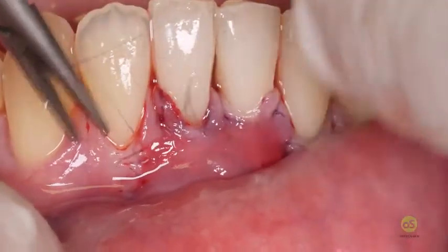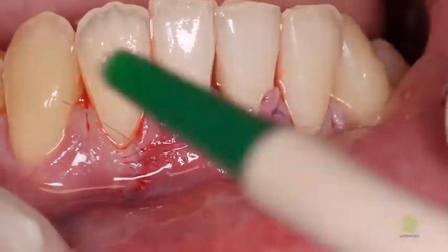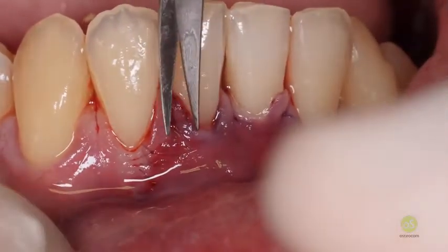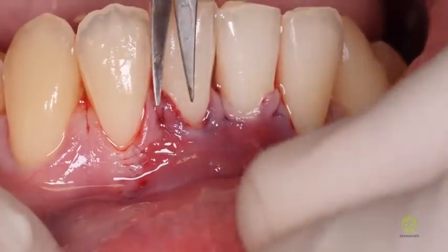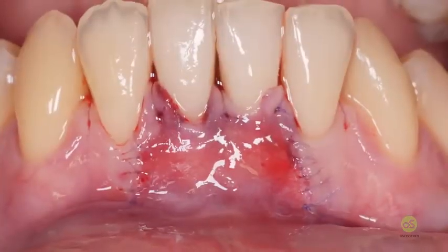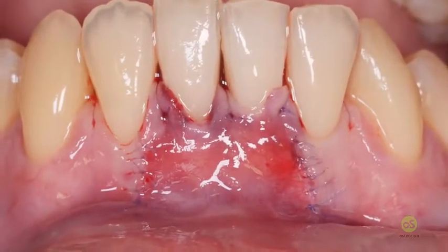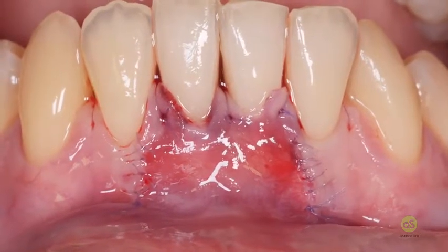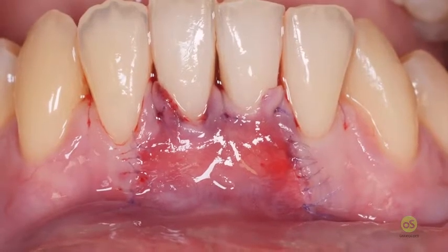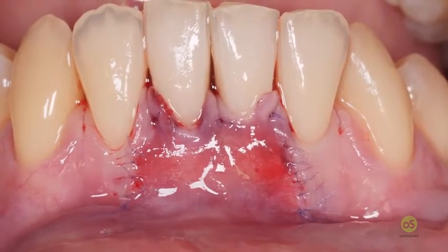Okay, now it's not finished, even if it should be finished theoretically, because you don't have to forget that the vertical release incisions were closed where there was still a lot of tension. You see how the flap is completely vertical, and will be even better when I'm going to show you the profile of the patient.